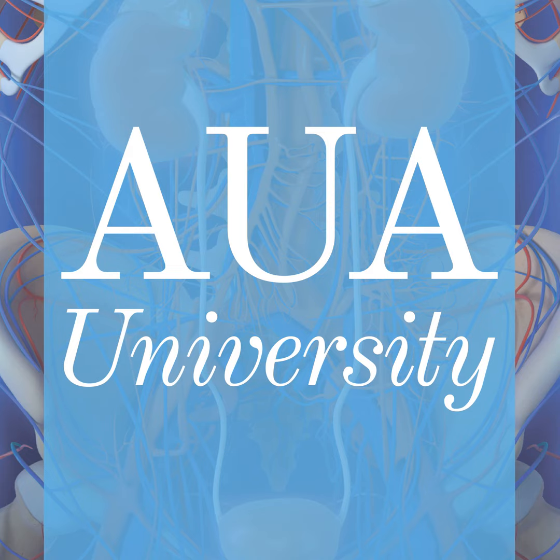Yeah, thank you for that question. You don't always need imaging, right? So if it's an unusual situation, if the history isn't quite what you would expect, if the location isn't quite what you would expect, then you may want to go for additional imaging. So you don't always need pathologic or imaging to follow it up. It's more if it's unusual. There are certain circumstances for bony lesions. Depending on, as we spoke about, you may want to get additional imaging, whether it's an MRI, a really bone-dedicated CT, to look at some bone findings, depending on what tracer you use.